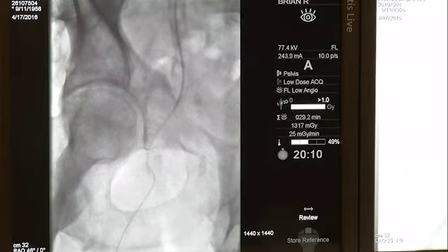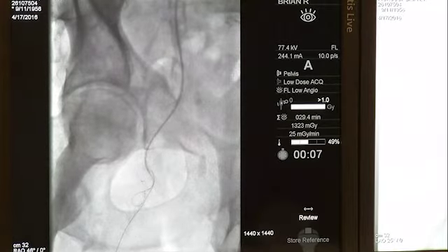Andy, can you tap this in? Bring the wire in and encourage it, just tap it. Yeah, tap it in there. Go ahead. So Andy is going to try to tap it in. Push, push, push.